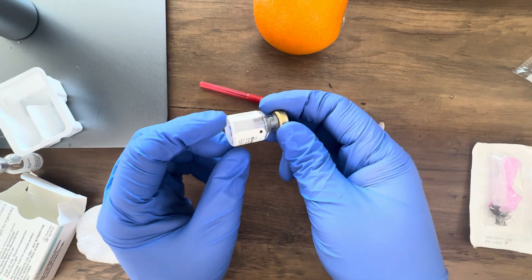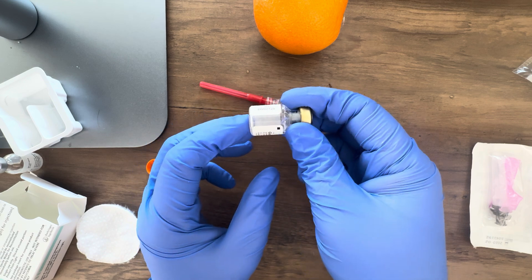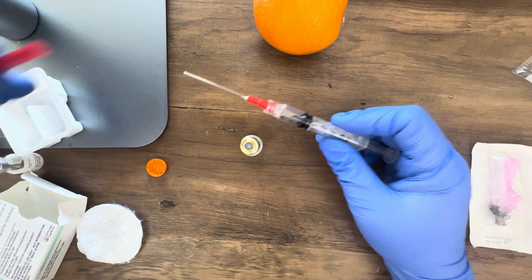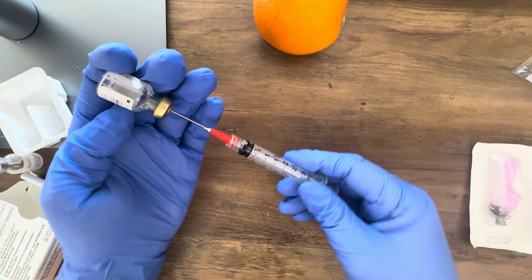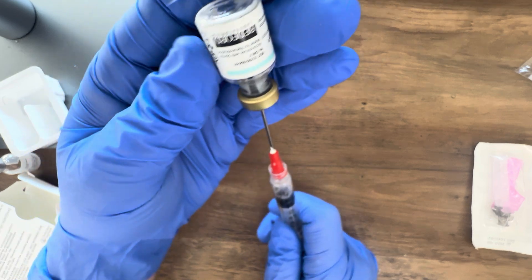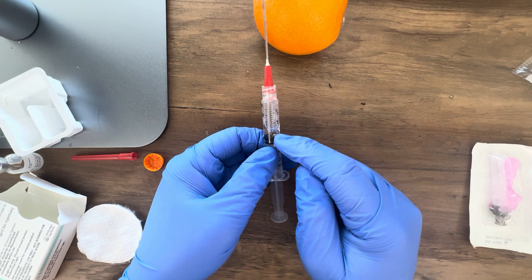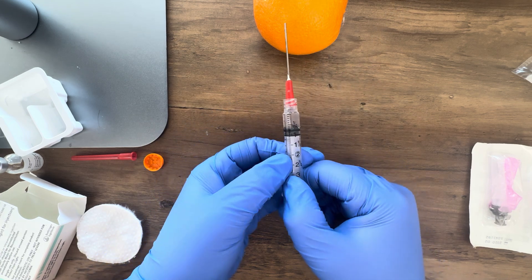Once you've rolled it in your hands a few times, look through the window on the side to make sure all the powder is dissolved into the liquid and the medication is ready to draw up. I'm going to draw the medication back up into the syringe — it's about one ml so I've pulled up one ml of air, put the needle through the stopper, pushed in the air, and drawn out the medication. I then turn my syringe vertically and push the air out through the top, leaving me with my one ml of medication.